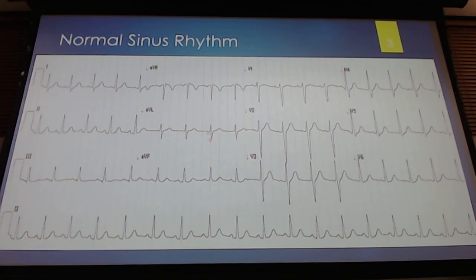The other thing I want to point out is look at those precordial leads. Yesterday we talked about in those precordial leads that R to S change. Okay? R to S change. In V1, we normally are going to have a very small R with a pretty prominent S. Do we see that? Yes. First deflection after that PR segment is an R, little tiny R, but look at that big S. That's because we're away from the left ventricle. We're overlying the right ventricle.